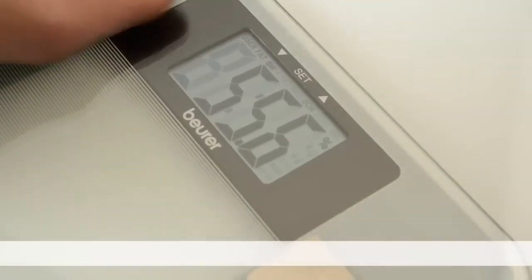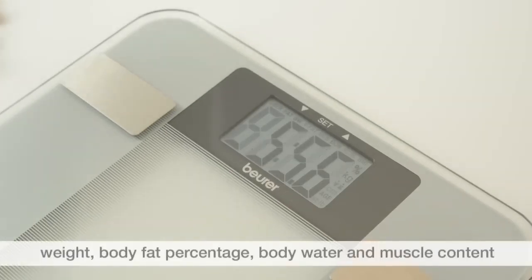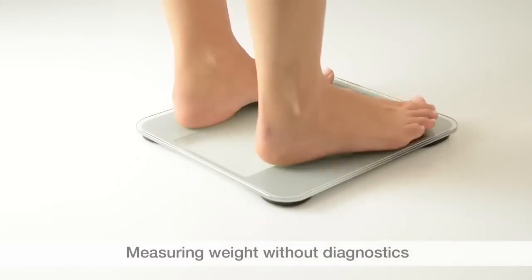The measurements are shown in the following sequence: weight, body fat percentage, body water content, muscle percentage, and BMI. If you would merely like to weigh yourself, just step onto the scale.